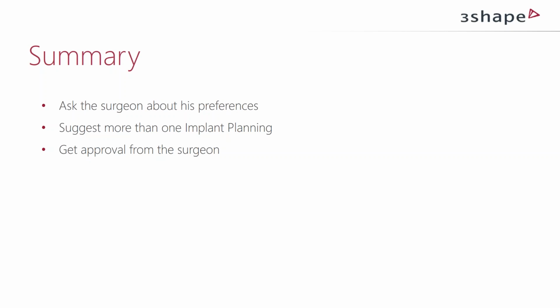The question can be answered like this: the first kits will be launched with full drill sequences with version 16.2 of Implant Studio, which I promise you here today will be available before Christmas. So an early Christmas present, and there we will include the full descriptions of BioHorizons' guided drill sequences, and Straumann as well. Then we will gradually launch more and more over the following months. It doesn't require you to update your software, just your implant libraries when you're prompted that there are updates.